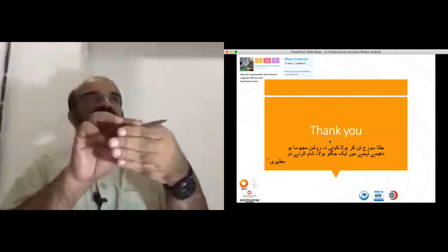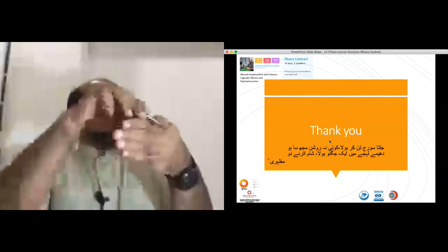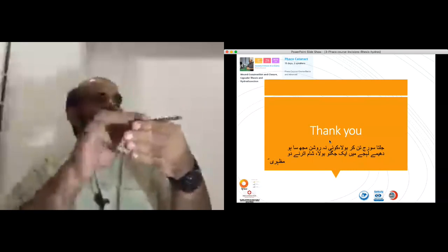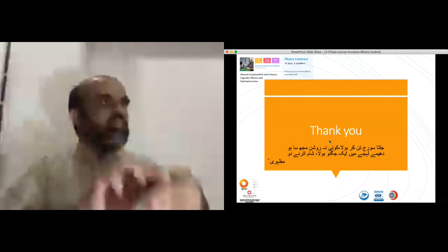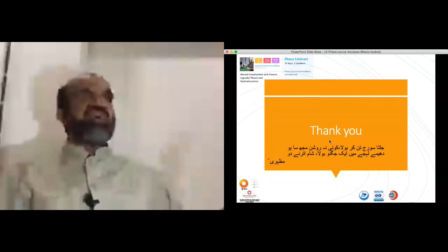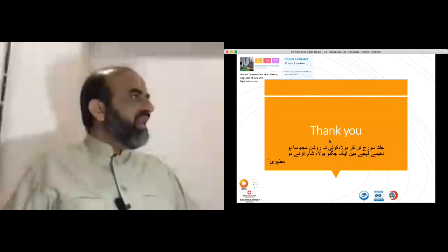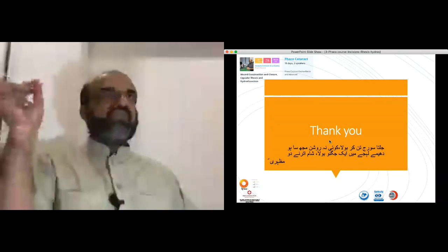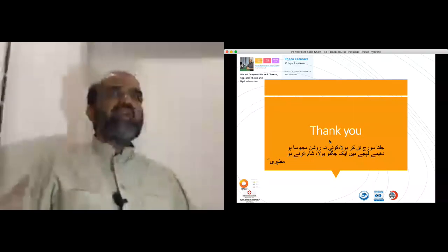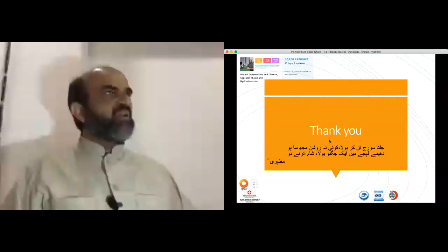Keep your incision lip as a fulcrum, and moving the external limb of this needle will generate the movement inside. Don't move like that. So that's the first thing. Second, enter through the side port incision so that the chamber doesn't collapse again and again. And have a separate stab incision for completion of your rhexis to begin with. And keep your anterior chamber deep, and you can practice with potato peel as well.